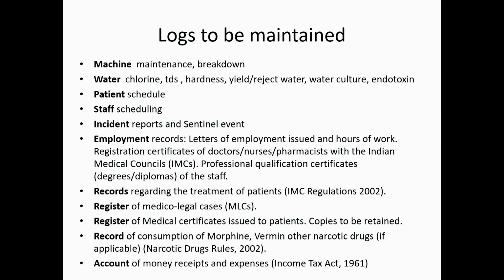And these are the logs which need to be maintained. Again, this may not be complete, but these are logs related to the machine, to the water, to the patient, staff, scheduling. Incident reports, I want to highlight.